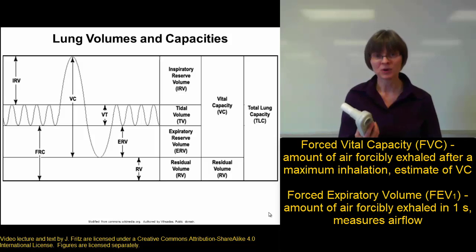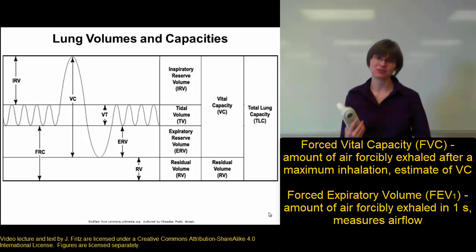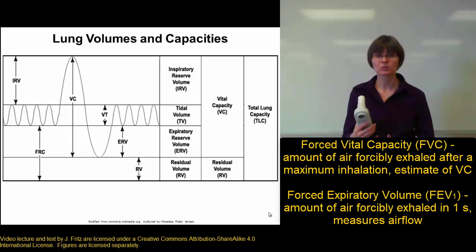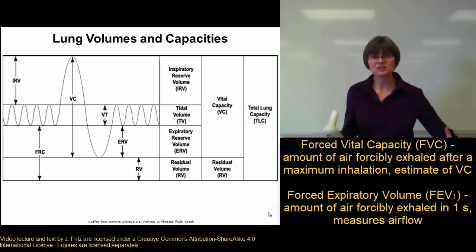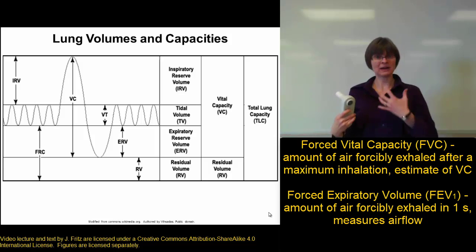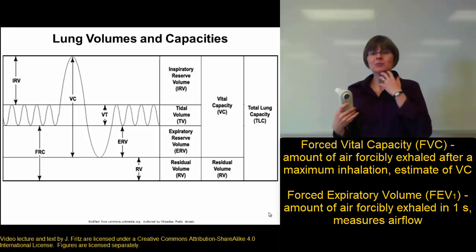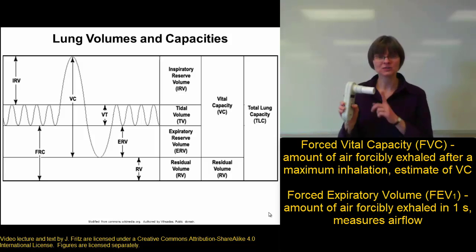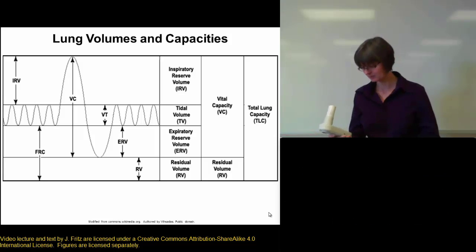One thing about spirometry is that it requires effort. It requires a lot of effort. To do this well, I have to work really hard. What I'm going to do is take in a really deep breath, the biggest breath I can get in. So I'm going to try and get all my inspiratory reserve volume in there. And then I'm going to blow out as hard and as fast as I can through this mouthpiece, and then I'll measure the volume with the spirometer.